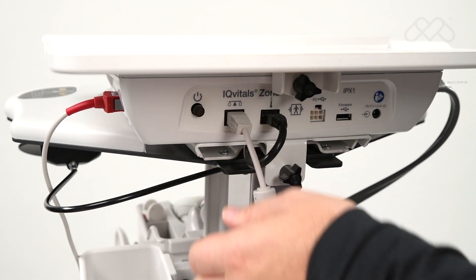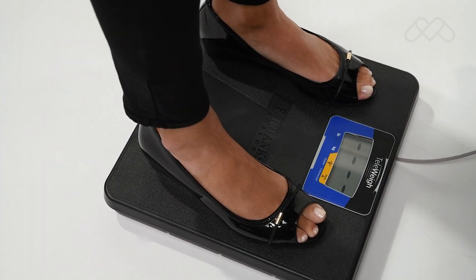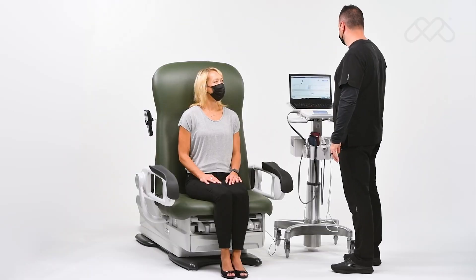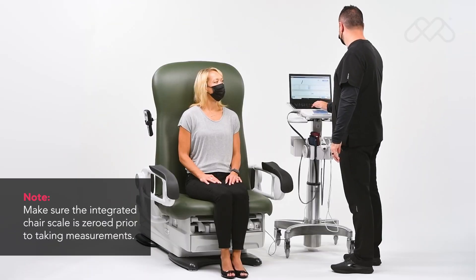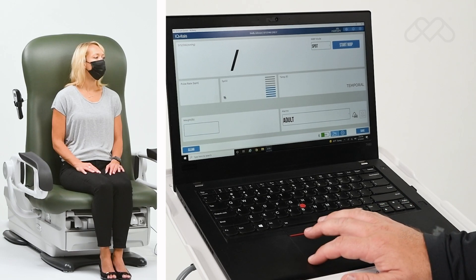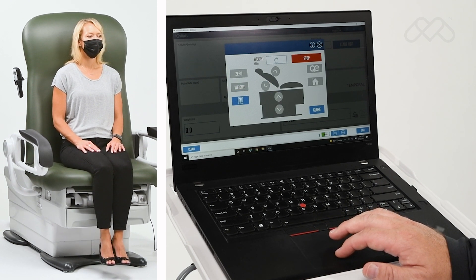If the Fairbanks TelAway digital scale is connected, the patient may simply stand on the scale and the weight measurement will automatically transfer to the IQvitals Zone device. If the Midmark 626 with digital scale is connected and enabled in the settings menu, a chair icon will appear on the bottom of the screen. Press the chair icon and from there you may capture a weight measurement or control the chair movement directly from the IQvitals Zone device.